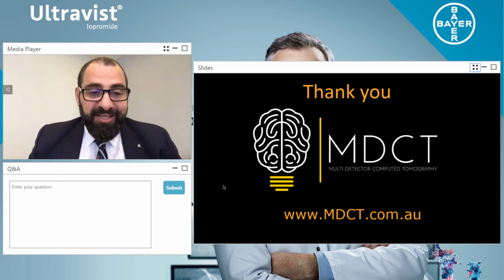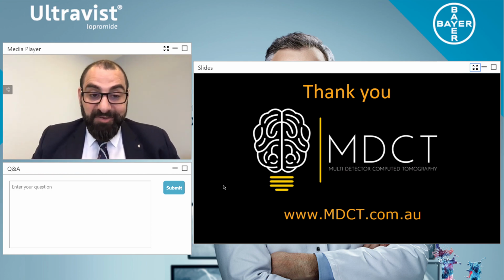That's a really good question. That's based on the enhancement pattern of the lesion. Remember, we saw it. It looks like hemangioma. It could be cystic hepatocellular carcinoma, or it could be cholangiocarcinoma. And it all comes back down to the contrast media and the waiting time. I can't answer what certain radiologists say, but in this instance, in imaging technique, we need to differentiate these lesion enhancement patterns, and that's what's important here.